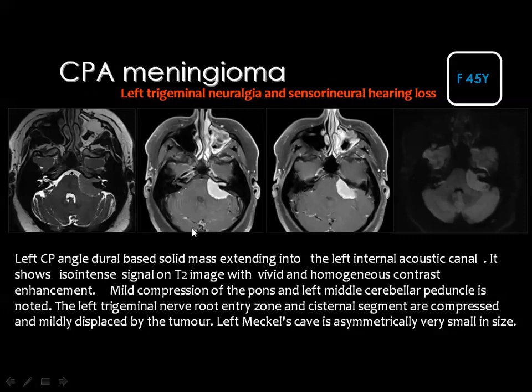If the lesion is an acoustic neuroma, it will arise inside the expanded canal, starting with destructive changes of the canal, then it may extend outside the internal canal. But you may say that some of the tumors will arise from the extracanalicular course of the acoustic nerve.